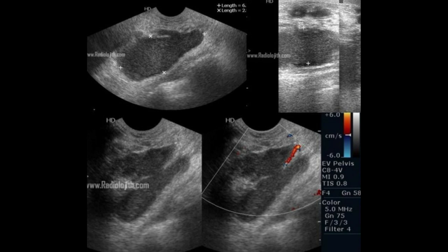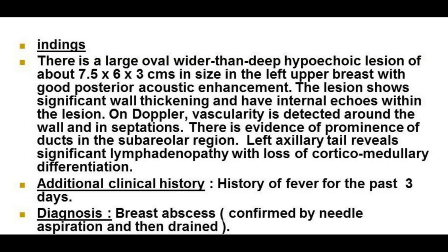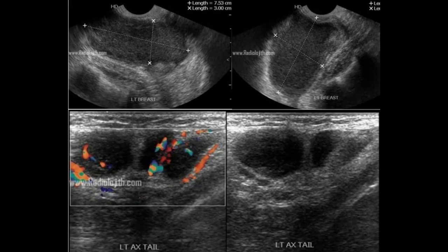Let's go! The first picture shows a large oval, wider-than-deep hypoechoic lesion with good posterior acoustic enhancement. The lesion shows significant wall thickening and has internal echoes within it. On Doppler, vascularity is detected around the wall and in the septations. The axillary tail shows significant lymphadenopathy with loss of corticomedullary differentiation.